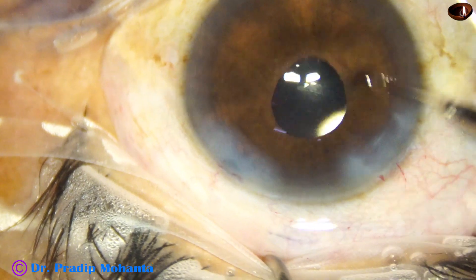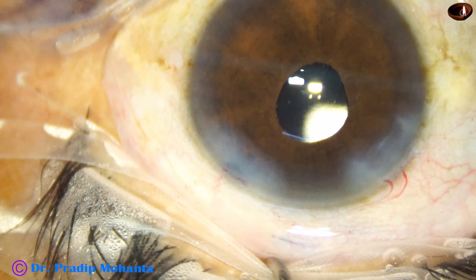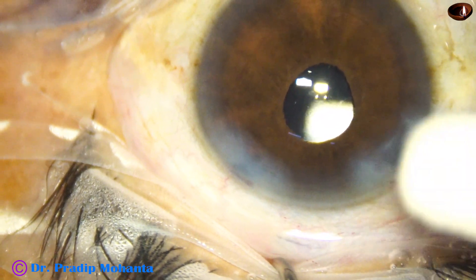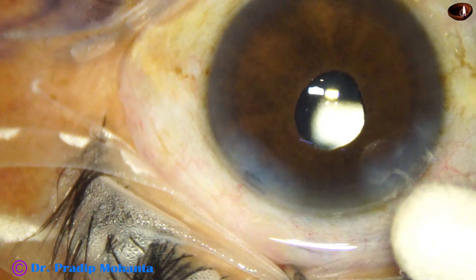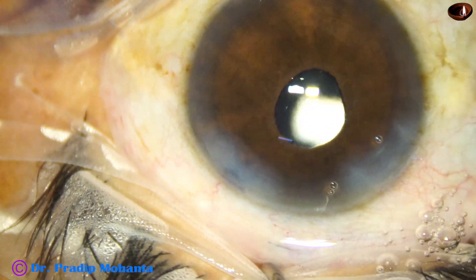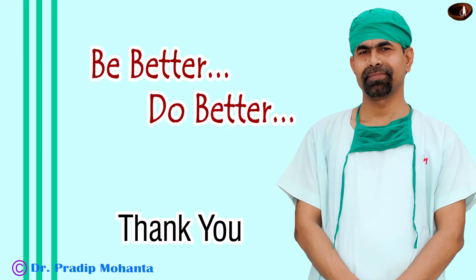The anterior chamber is nicely formed after a final lavage. A few drops of moxifloxacin are applied over the ocular surface. The integrity of the wounds is checked and then the case is concluded. Thank you very much for your attention. Hope this video will help you in developing your surgical skills. Be a great surgeon and serve your patients with love, respect, empathy, and great surgical competence.